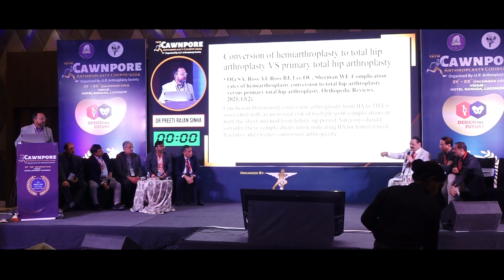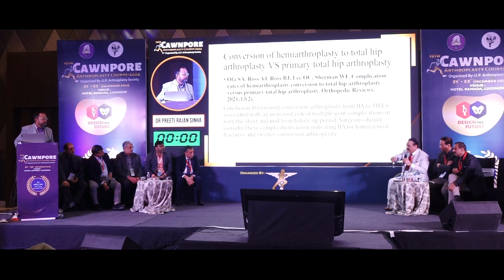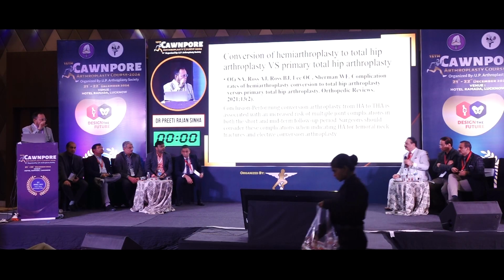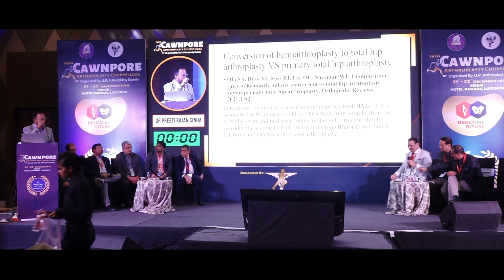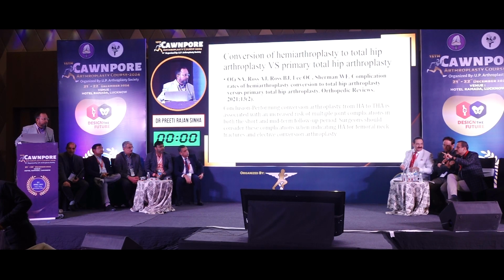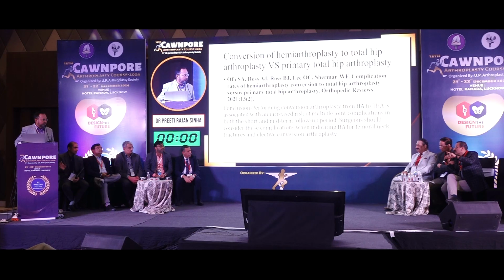There is a question, just because we will have time later on. Did you encounter any difficulty dislocating or taking it out? No difficulty at all, sir. It came out very easily. Once we removed the scar tissue from the anterior and posterior stem, it was very easy to take out the stem. How old was it? Eighteen months. Sir, many times the bone grows in between the holes. Yes, sir. The stem was loose.